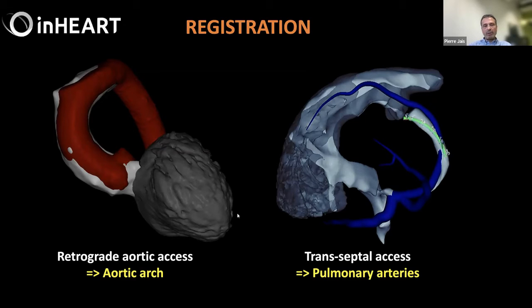We have a final verification where we advance the ablation catheter in the LV down to the apex and make sure that it's not out of the cardiac model that has been reconstructed from imaging.